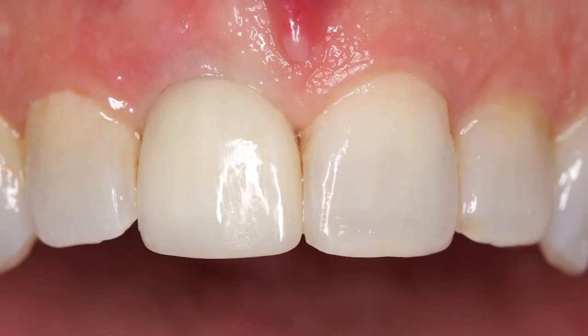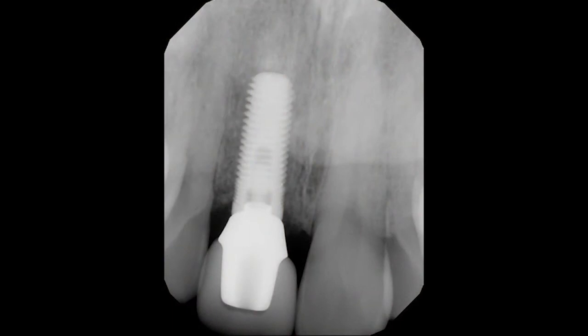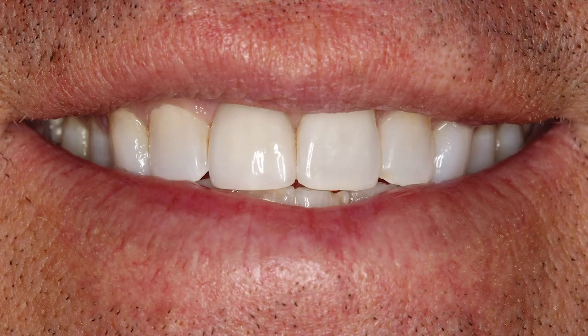Note how the interdental papilla and soft tissue contours established by the custom healing components allow for the ideal crown margins. The patient was thrilled with the final implant results in the aesthetic zone.